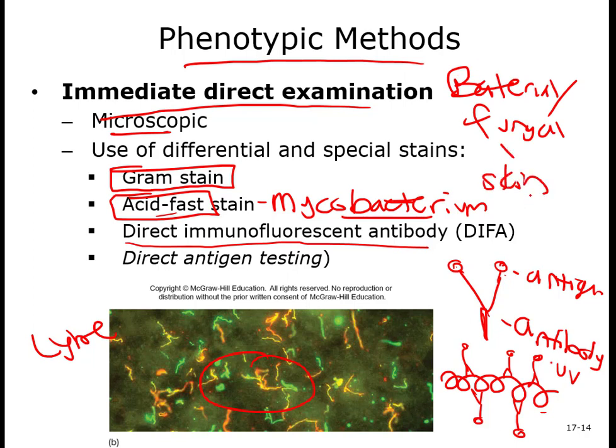If somebody comes with a rash and they don't know if it's a yeast infection or a bacterial infection, they could simply take a swab or scraping of the rash. They could really quickly look at it under the microscope and say, hey, it's fungal, we need to use an antifungal skin treatment, or if it's bacterial, they can prescribe the proper treatment for it.